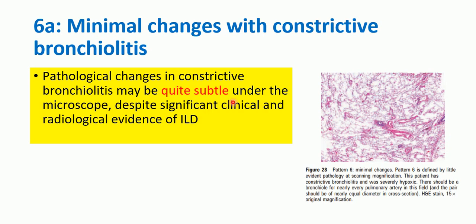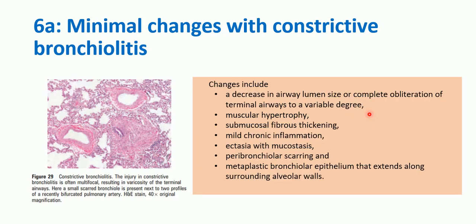So the changes in constrictive bronchiolitis are near normal, quite subtle. You cannot see anything abnormal. Oh, it's a normal biopsy. But this patient was a case of constrictive bronchiolitis and severely hypoxic. So this is not in concordance with what the patient is showing.